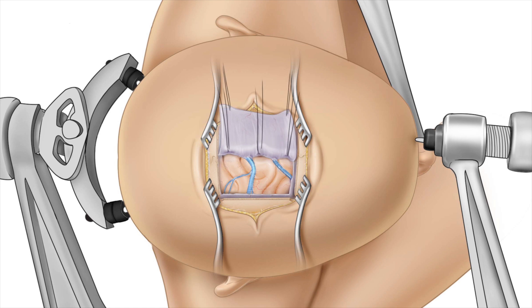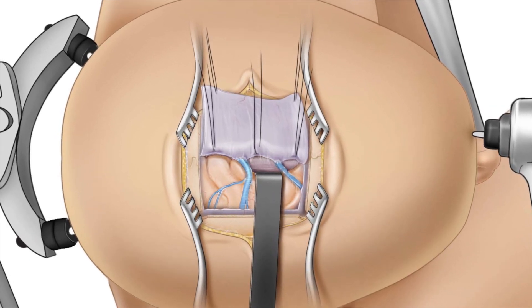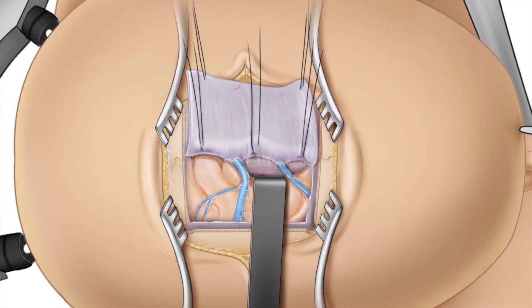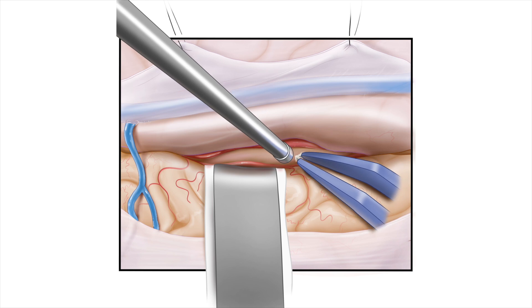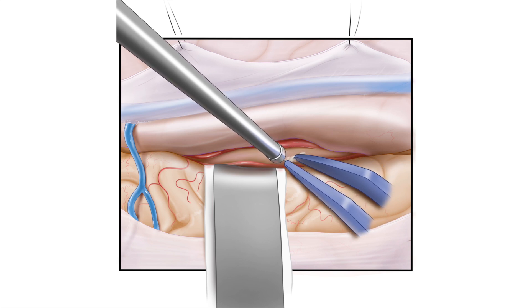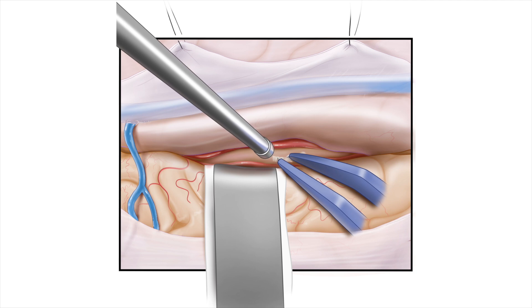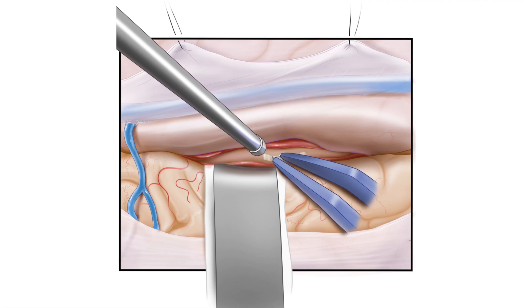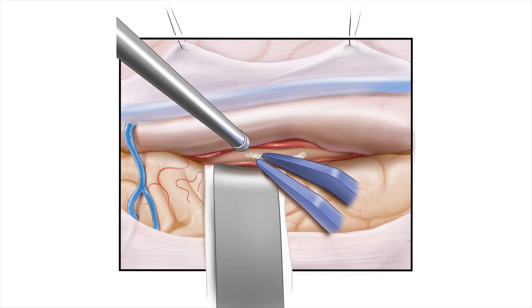You can appreciate the presence of multiple cortical draining veins, which take venous blood from the surface of the brain and drain into the superior sagittal sinus. Using a retractor, or just the presence of gravity, allows us to access the interhemispheric corridor. This allows us to follow the falx cerebri down into the deep recesses of the brain, where we can appreciate the superficial part of the corpus callosum, the large white matter tract that connects the two cerebral hemispheres.